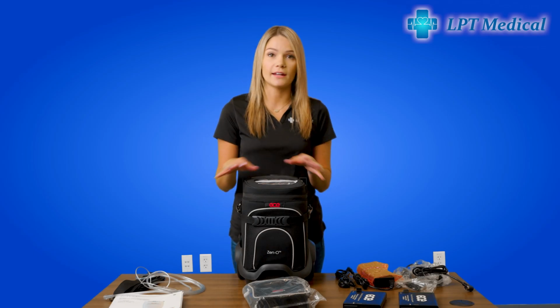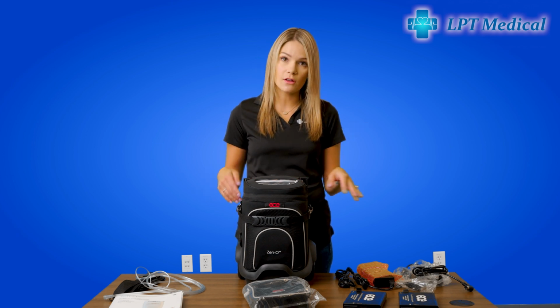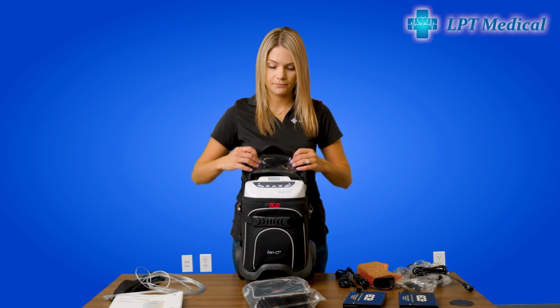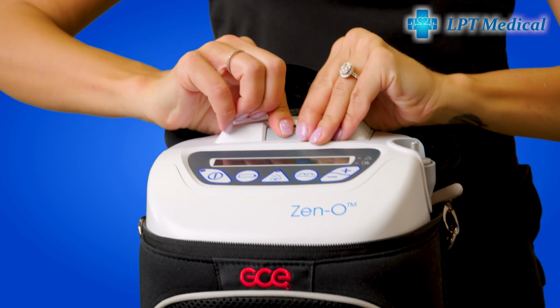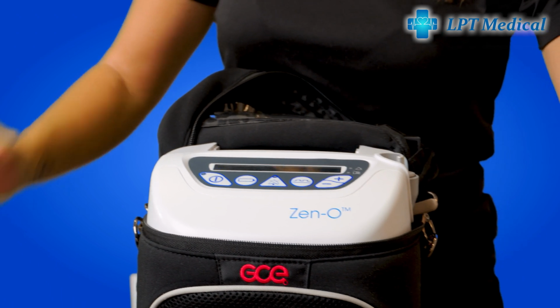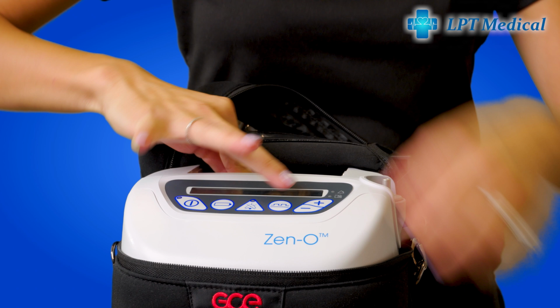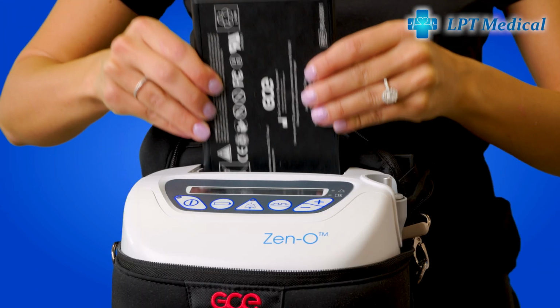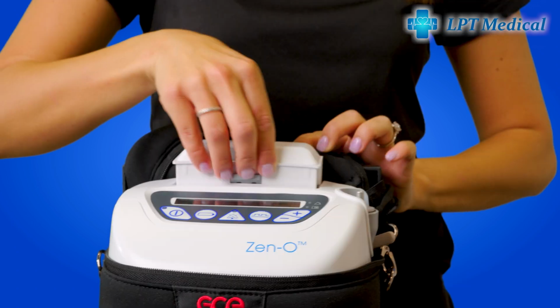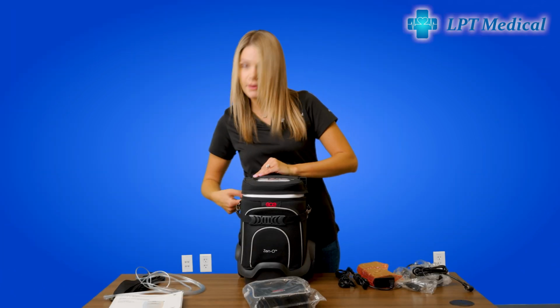So now that we have everything laid out, I'm going to show you how to set up your GCE Zeno for first time use. First, we're going to install the batteries. So you're going to unzip the top part of the carry case. There is a little lever back here. You will just pull this off. The unit will hold 2 batteries at a time. They just slide directly in this compartment. Reattach the lever. Zip the top part back up.